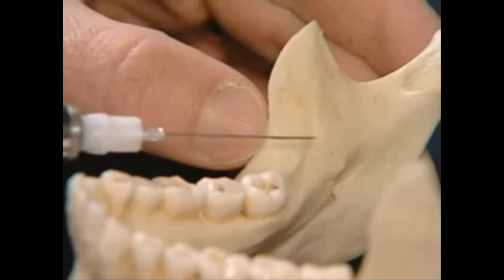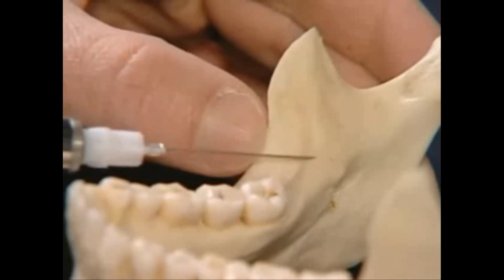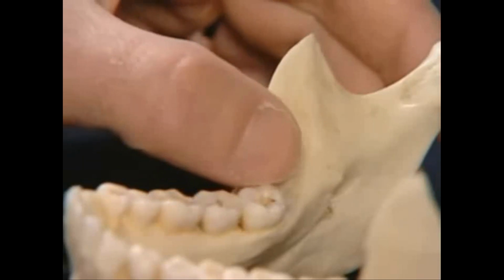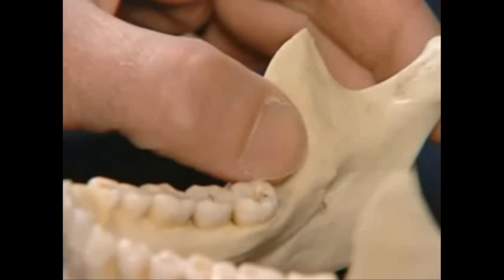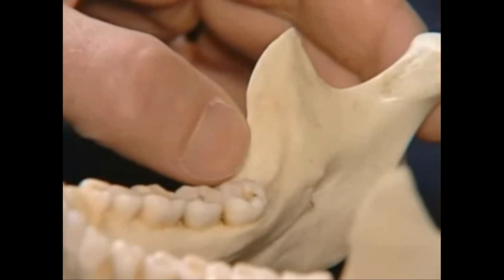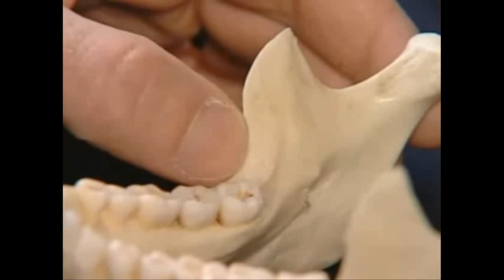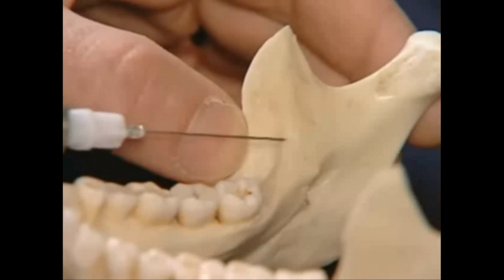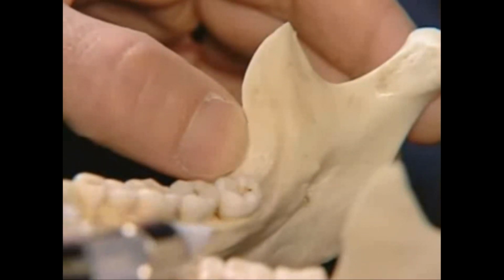The next stage is to palpate the internal oblique ridge, which is the next prominence as you move your finger or thumb in medially. A mental note is made at that point, and then your finger or thumb is withdrawn laterally, pulling the soft tissue landmark with you. It is just medial to the internal oblique ridge that the needle will be inserted. At this point, you're ready for needle insertion.